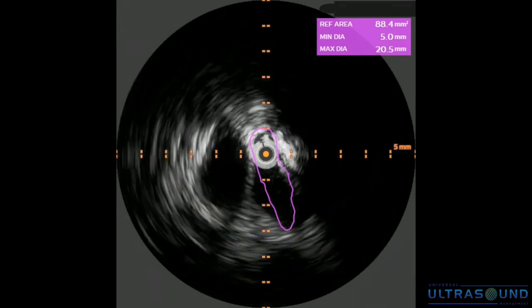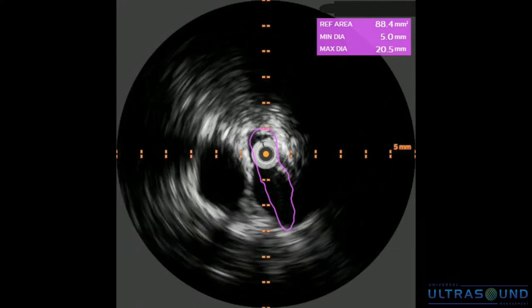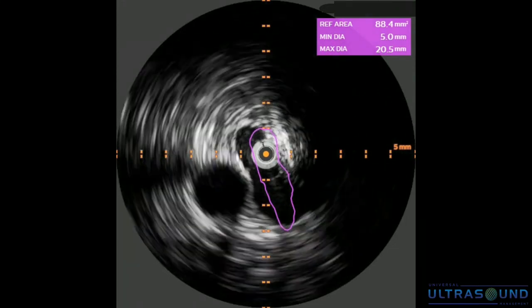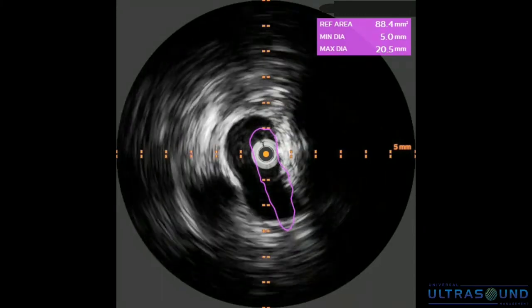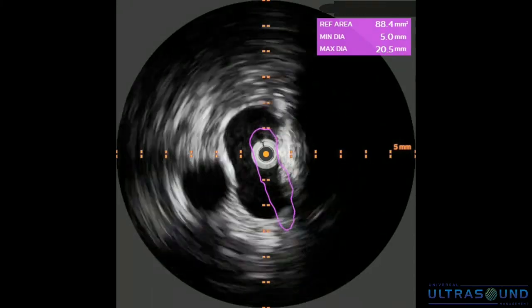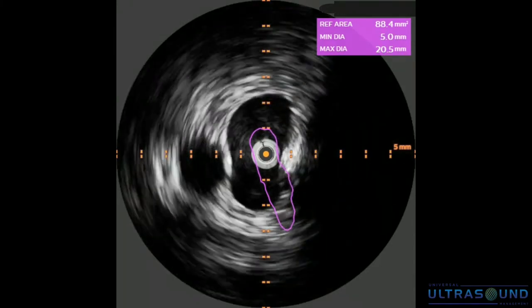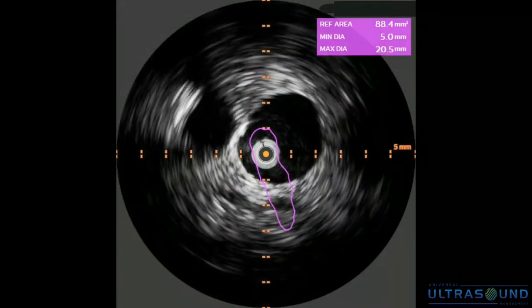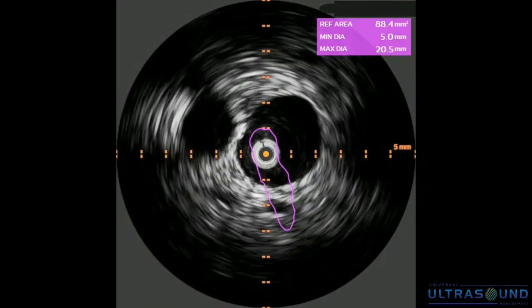As you can see, again, this is IVUS, so this is intravascular ultrasound. EVUS and IVUS correlate really well together, so I've always made it a challenge when I do these type of scans to see if I can match IVUS, and I always like to give myself a pat on the back when I do because it makes you feel good, right? But sometimes I'm wrong and it's okay, but I love to learn.